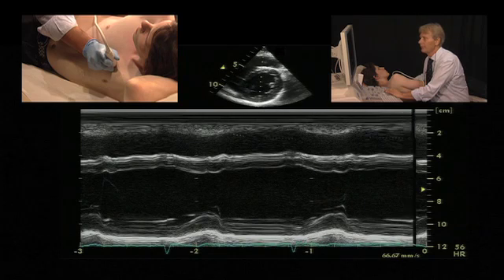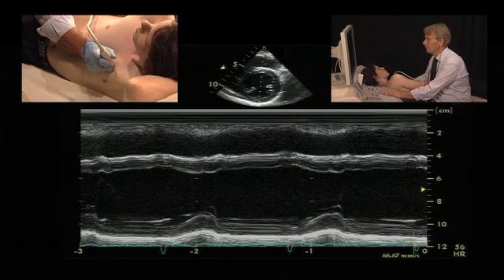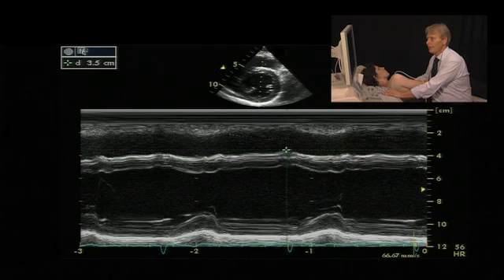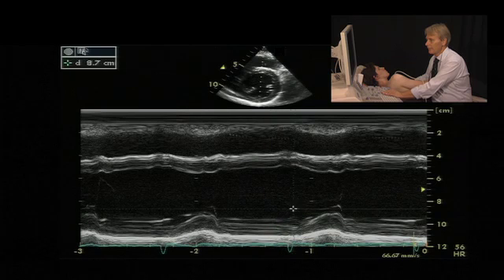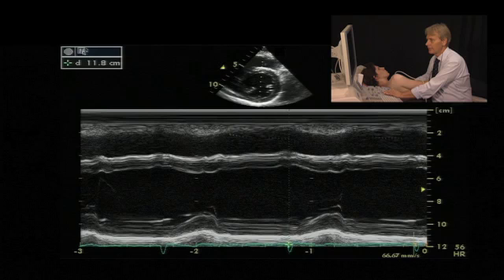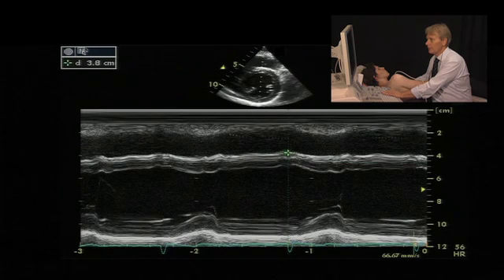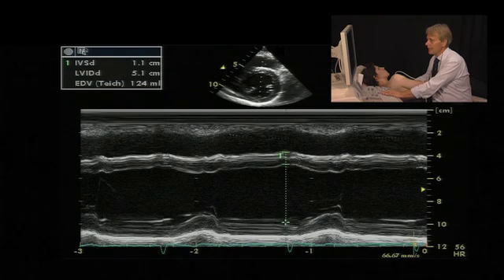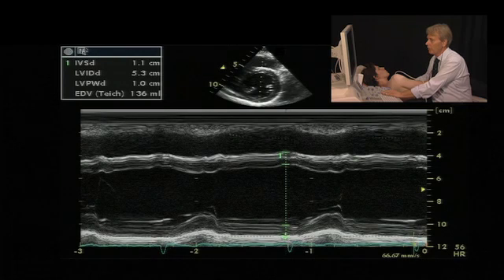Then freeze the image and perform the measurement of the septum at diastole. We have the biggest width of the left ventricle shortly before the QRS complex starts — this is where you would start with your M-mode measurement of the septum. Then you would measure the end-diastolic diameter and the posterior wall. All these measurements are at diastole.